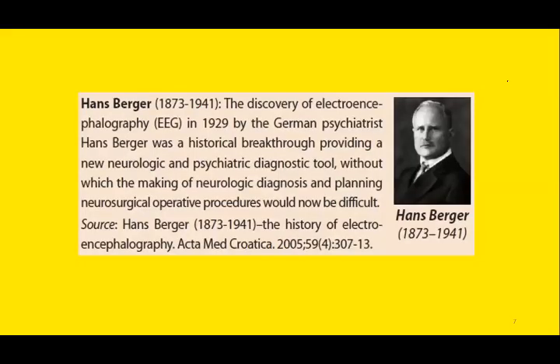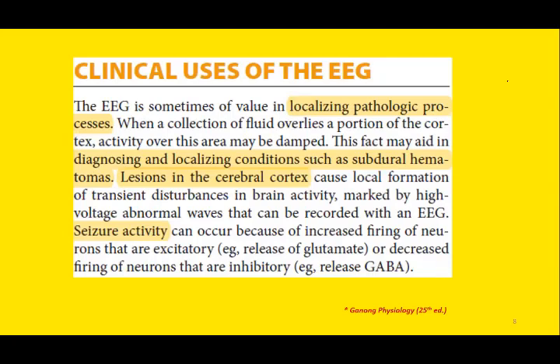Now we will move to the electroencephalography. The German psychiatrist Hans Berger was the one who introduced this procedure, this process of electroencephalography or electroencephalography. Both pronunciations are correct. And why do we perform EEG?